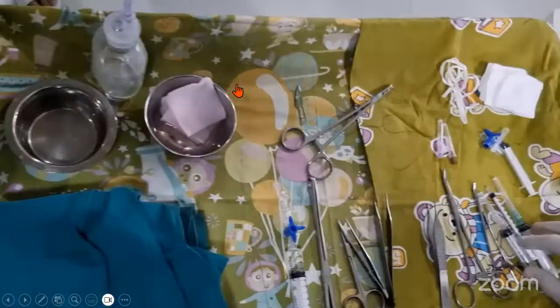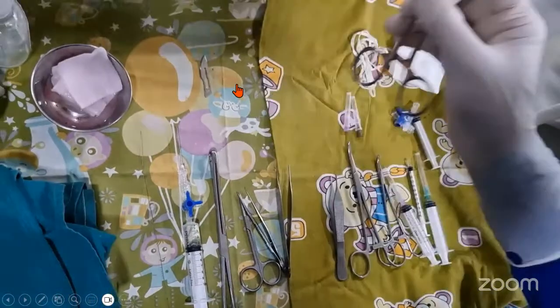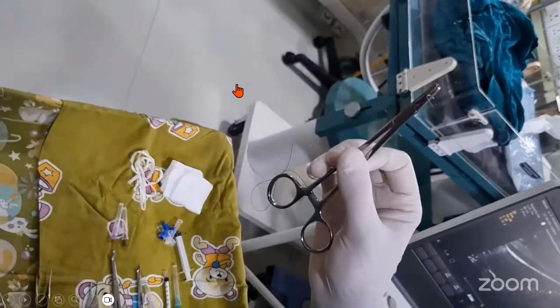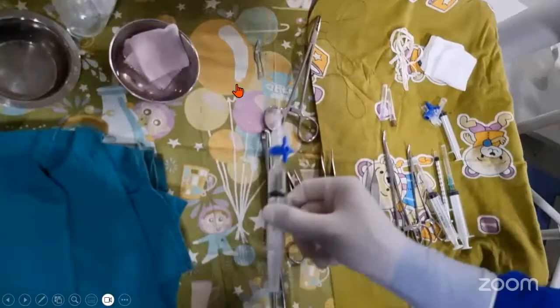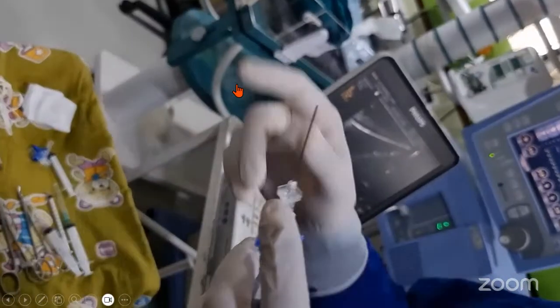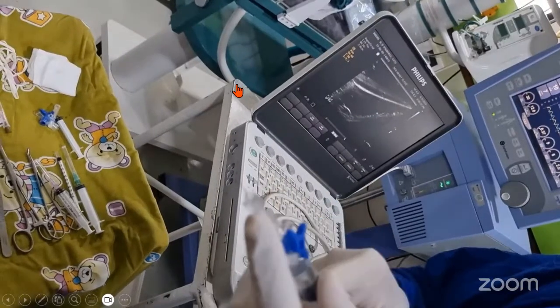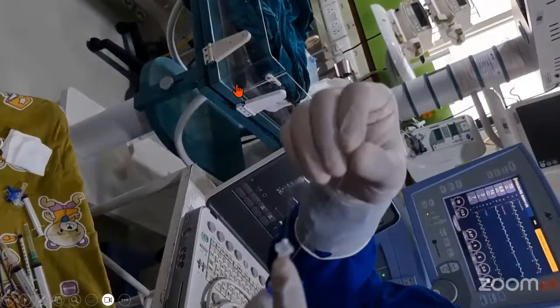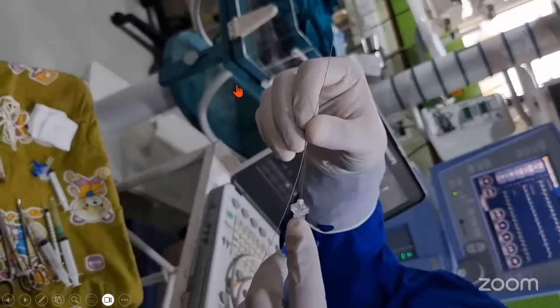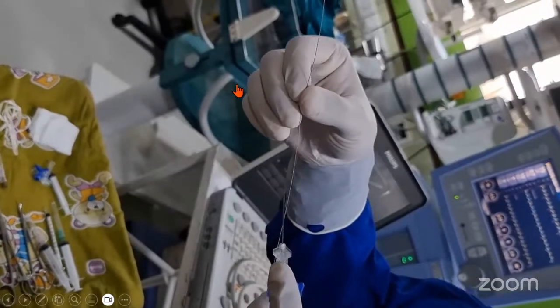So we do the gowning and everything. For the central line, you need to put the inserting needle, because this we do with the Seldinger's technique. Everything has to be a three-way cock, and you should prime it with normal saline so that there should not be any air. Okay, only the insertion, this is the guide wire. Only the insertion needle we will be doing with the ultrasound guided.